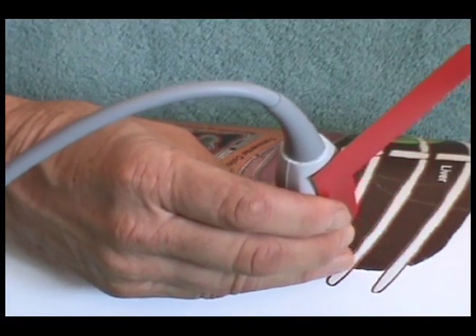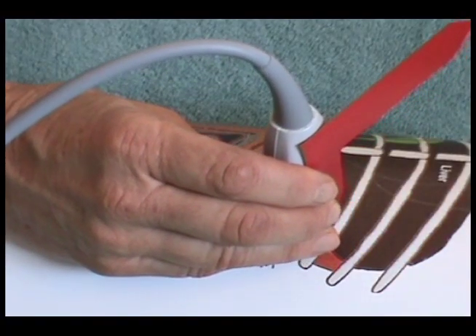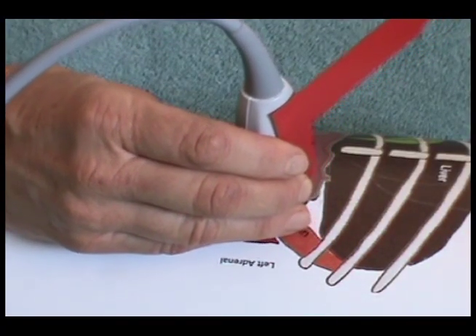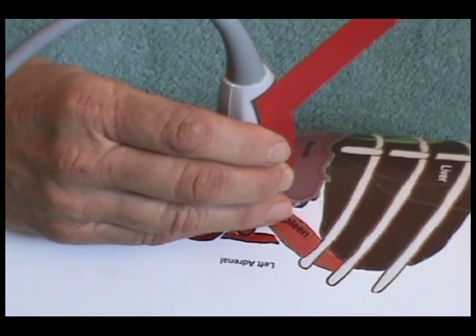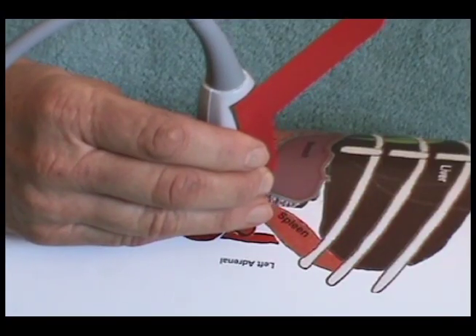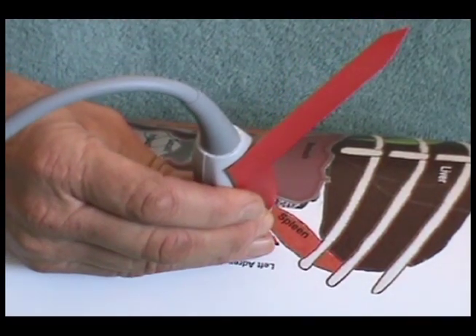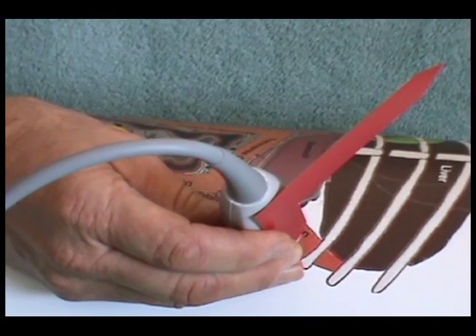In dogs, the spleen is often large, and all of a short axis view does not fit on the ultrasound screen. Keep the leading edge of the spleen centered under the transducer as you follow toward the tail of the spleen. At the tail of the spleen, reverse directions and keep the caudal edge of the spleen centered under the transducer as you follow back toward the head of the spleen.